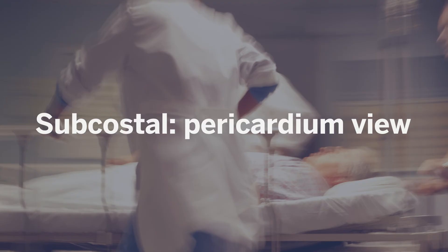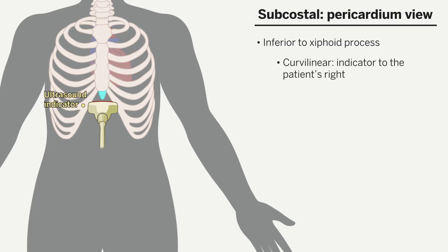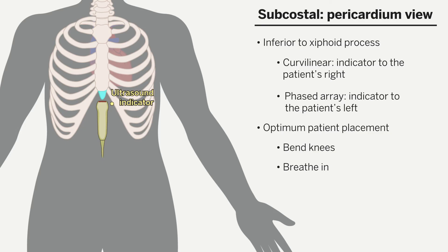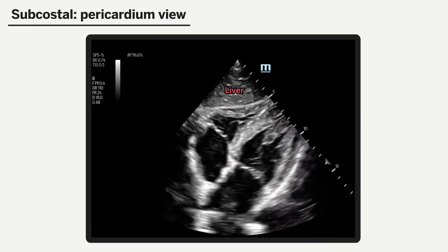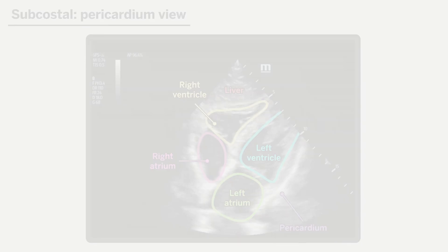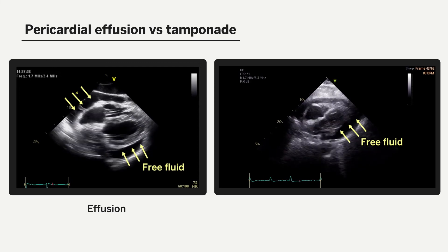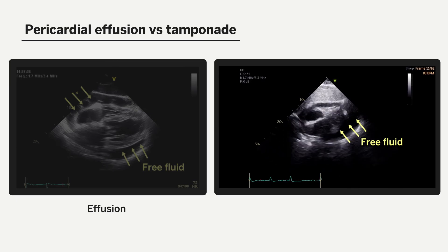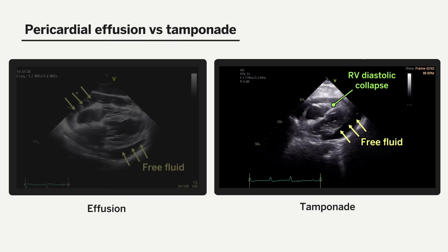To obtain the subcostal view, we place the probe just inferior to the xiphoid process. If using the curvilinear probe, the indicator faces to the patient's right; however, if using the phased array probe, the indicator faces to the patient's left. It is often helpful to have the patient bend their knees and take a breath in to optimize this view, and the ultrasound probe should be angled slightly anteriorly. In this view, we should be able to identify the liver, pericardium, and the two atria and two ventricles of the heart. This view is particularly useful for evaluating for free fluid in the pericardial space, as seen in these videos depicted by the yellow arrows. Both video clips demonstrate circumferential fluid collection, and the video to the right additionally depicts right ventricular diastolic collapse, suggesting possible tamponade physiology.